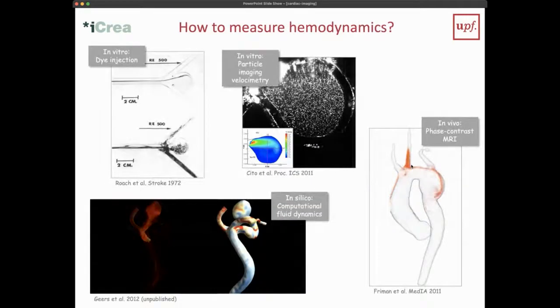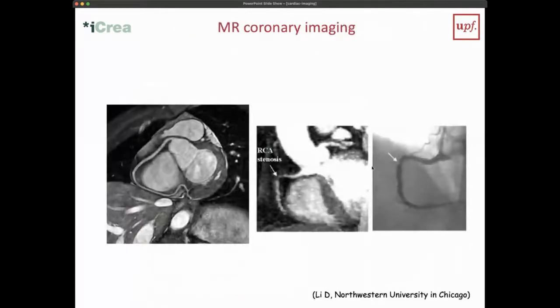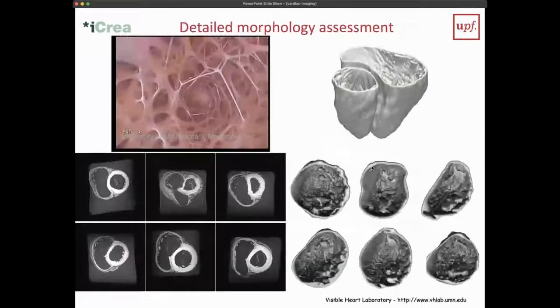One question, Bart. Yes, go ahead. In the previous slide, the block of gelatin, is it related with attenuation or is it just clinical? No, you just put it in a block in order to fix it.